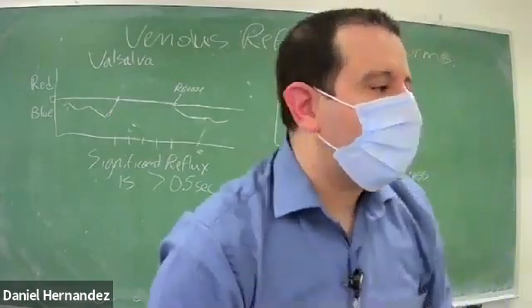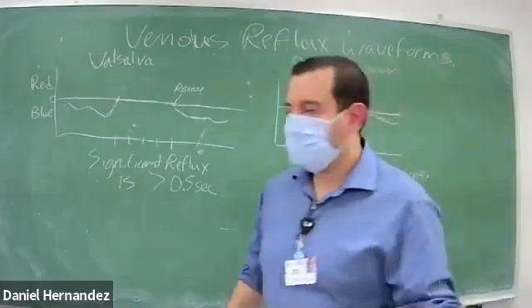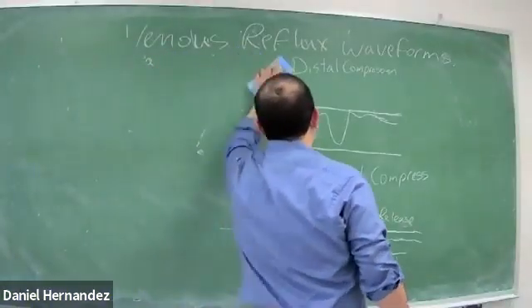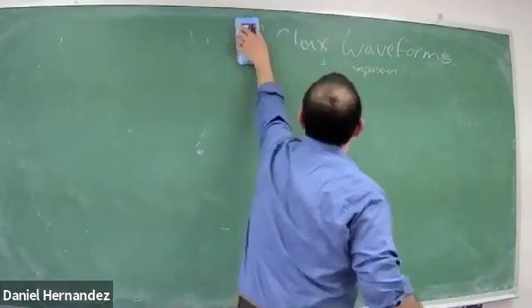Does everyone know where a carotid body tumor is located? Yeah, between the ICA and ECA. Yep, good. So it's going to be carotid body tumor. When you get that picture on your test or on your registry, it's only going to look like one thing. That's going to be a carotid body tumor.